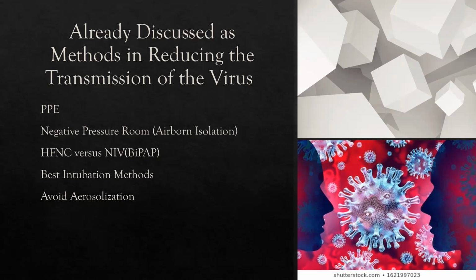And then the question is, does high flow spread the virus into the atmosphere as much as non-invasive ventilation does? Okay, so on BiPAP, you can add a filter to the exhaled air, but what about the leak around the mask? The goal would be to reduce the amount of virus in the atmosphere, I guess.